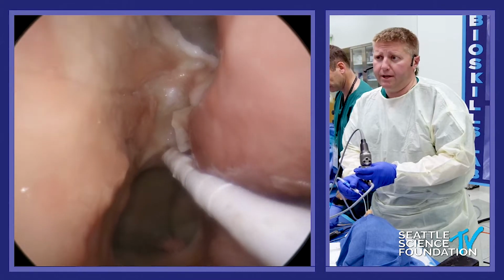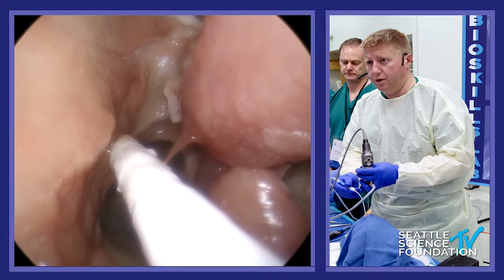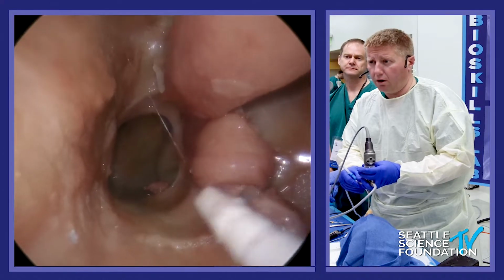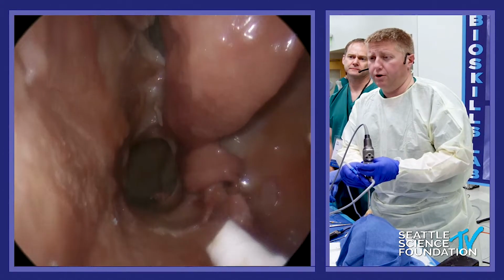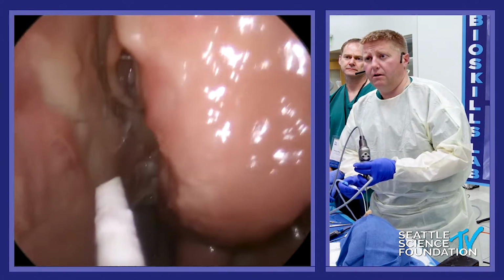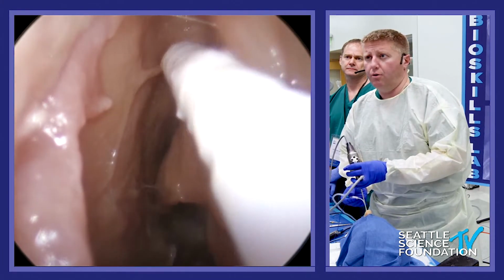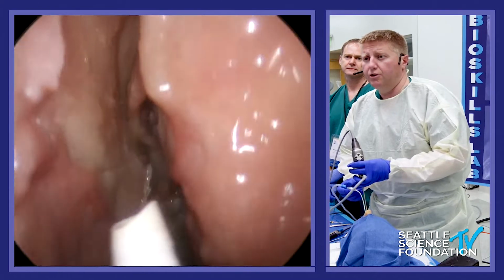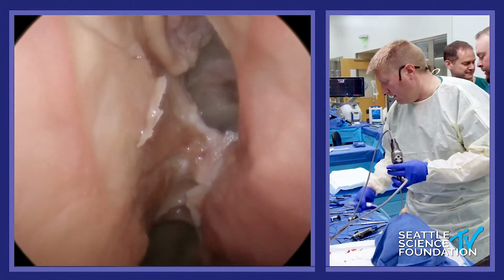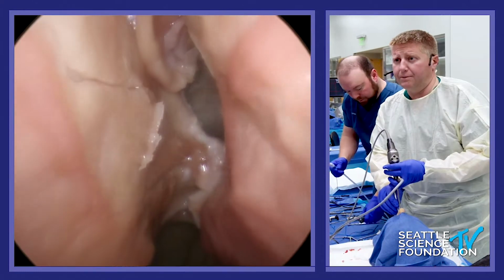And then depending on how big your defect is going to be, you can carry this inferior portion down onto the nasal septum, onto the nasal floor, or onto the inferior turbinate. You can really make it wide and then connect it anteriorly and then make a superior cut. Now you don't want to get up too high here because you don't want to disturb any of your olfactory fila. Usually I would make this cut with a needle tip bovie, so you have to be aware of the heat from that. And then once you've made those cuts, it really is just a septoplasty.